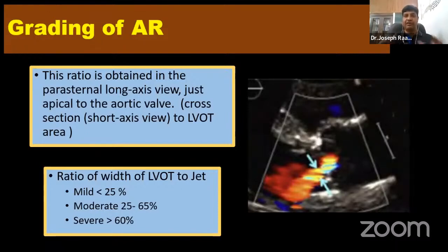This information gives you an idea whether this patient needs further consultation by the cardiologist, or whether you can still go ahead with the surgery. That's where this information is going to be helpful. I'm not saying that once you know this, you don't send the patient to the cardiologist. It's not like that. But in case of an emergency where you have to make a decision and you're not in a position to get cardiology help immediately, then if you know all this information, it's going to be very helpful and handy for you.